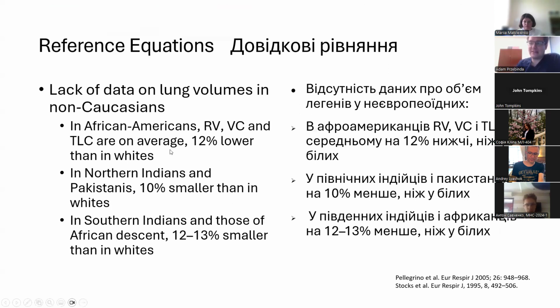In fact, some people argue that you should measure the seated height, the chest height, and use that as your reference point rather than your total height.